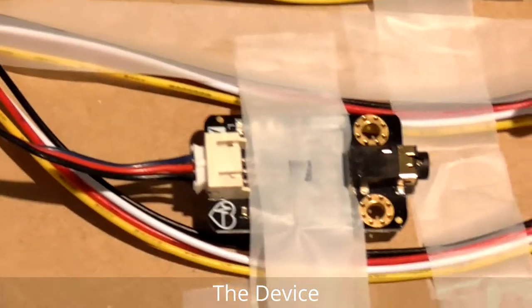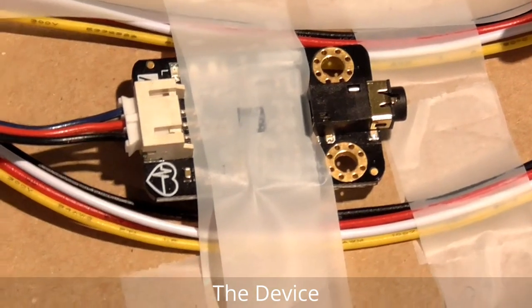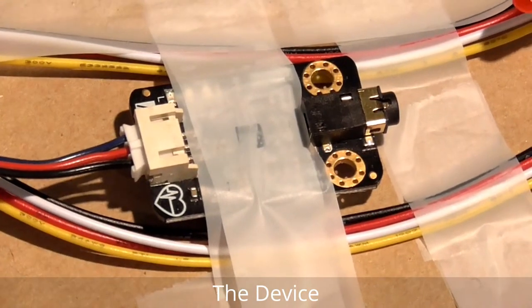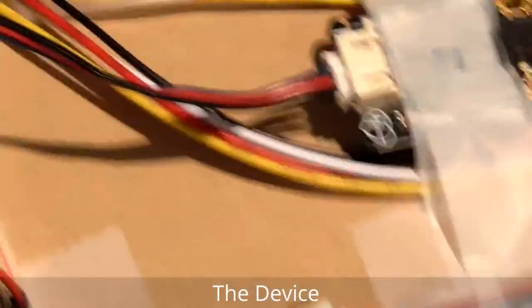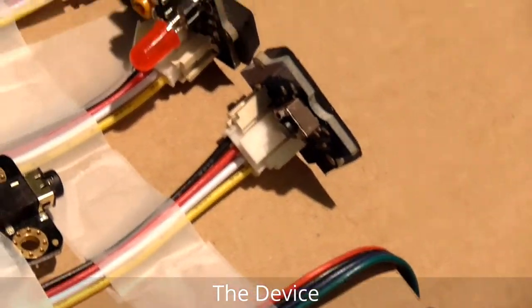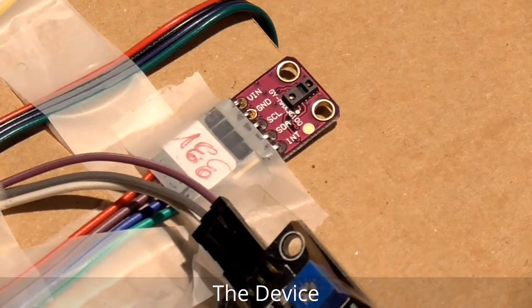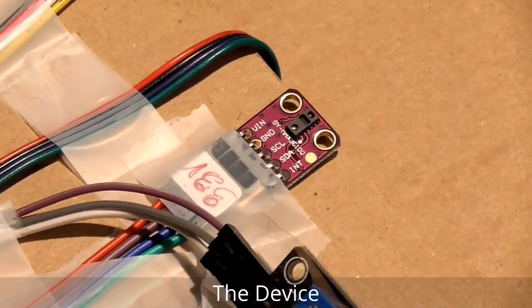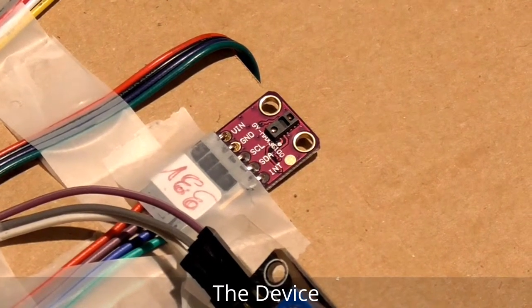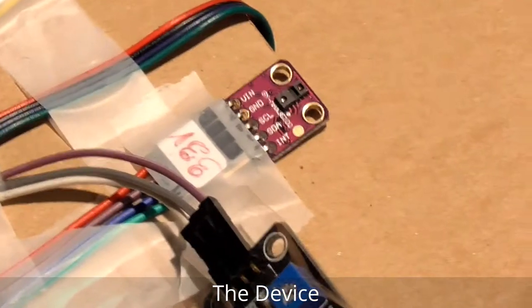This is the ECG sensor. Let me place it — okay, let's place it later. This sensor is called the pulse oximeter. If you place your finger on it, it can measure the pulse rate as well as the SpO2, which means the oxygen level.